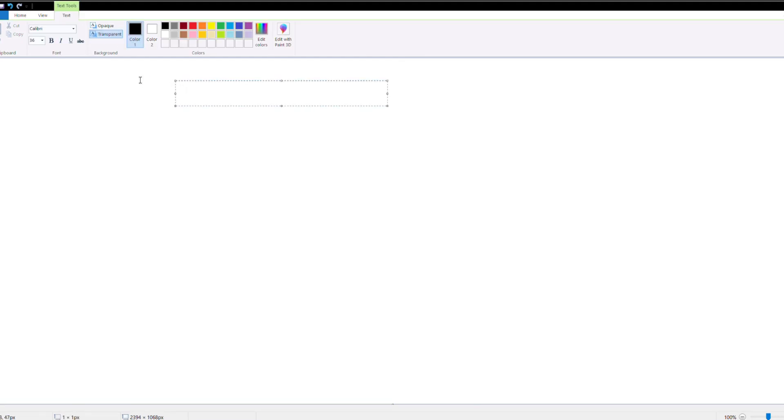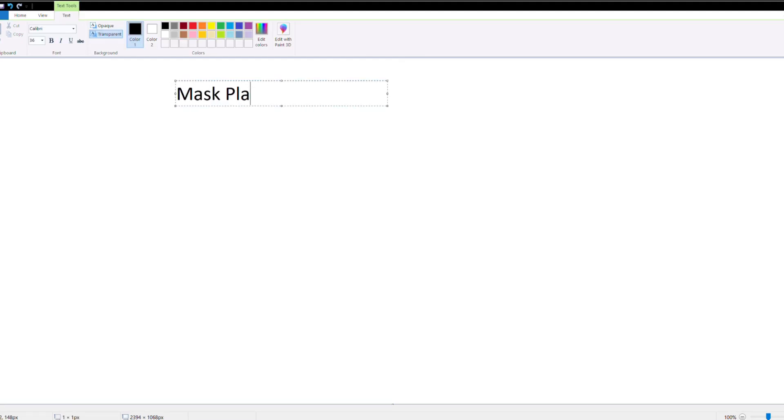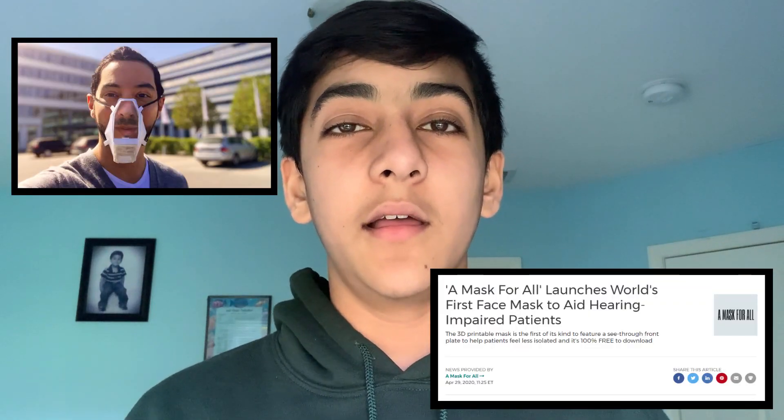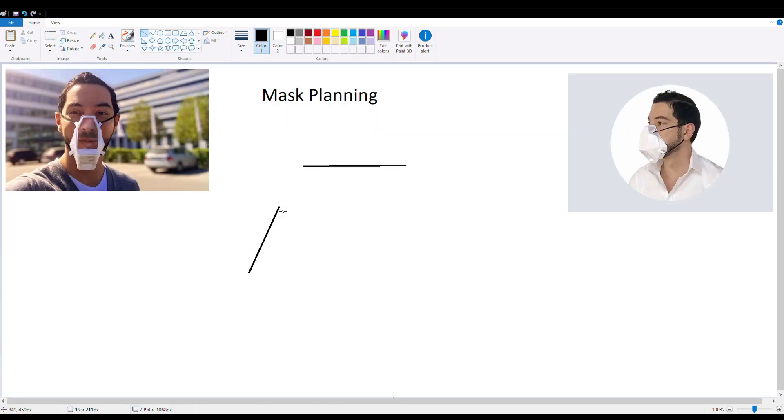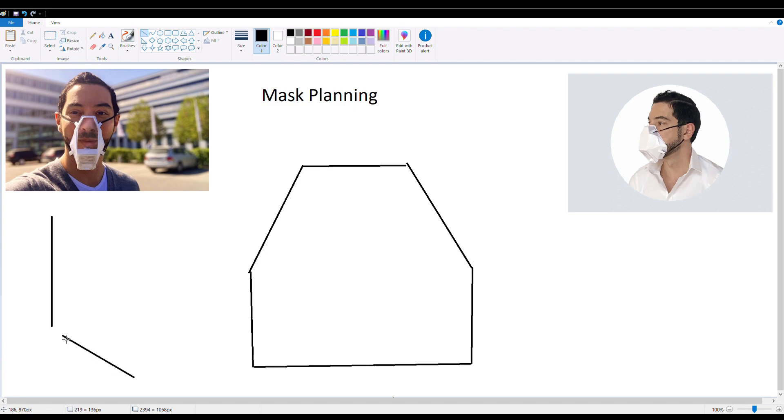Now the first step to designing this mask is to start planning it. So the group over at amaskforall.com has developed a 3D printable reusable mask design that they plan to release. They also recently released a press statement where they had plans for a transparent front on their mask in order to accommodate hearing impaired patients. So I'm drawing the front of the mask now, that's what the shape is going to be like, it's kind of wide.